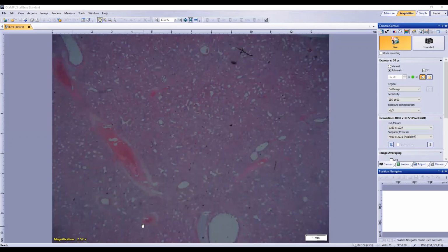So talking through all of this is building up our mental list of potential etiologies, and there'll be particular features with each of those. So we've talked through the herpes one. What else could do multinucleated giant cells in a lung?